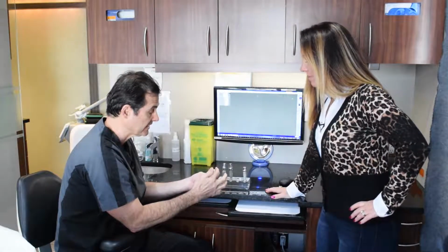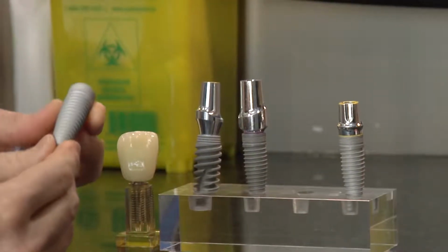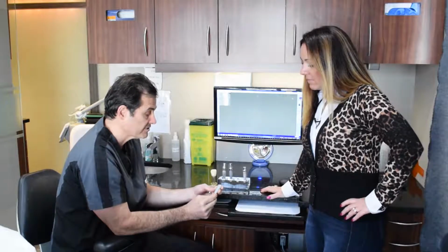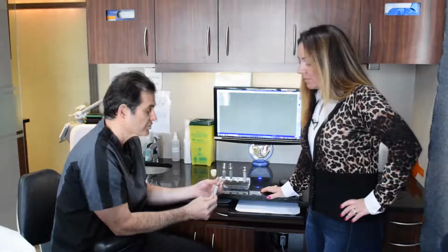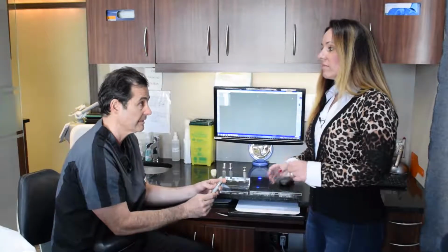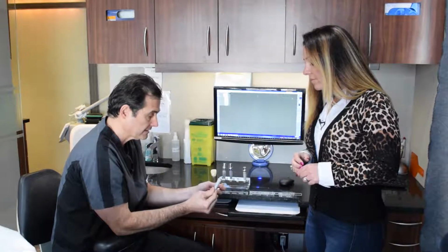It's basically a titanium screw. We're seeing some new materials coming around nowadays, a porcelain implant made of zirconia, being advertised as metal-free because it's tooth-colored, it's white. Zirconia is technically a metal though, so don't be fooled into thinking they're not metal. They are, but they're just a white metal. So this is an implant.